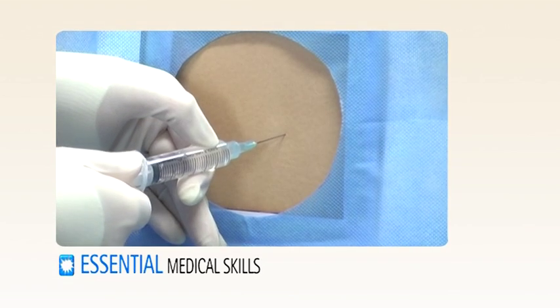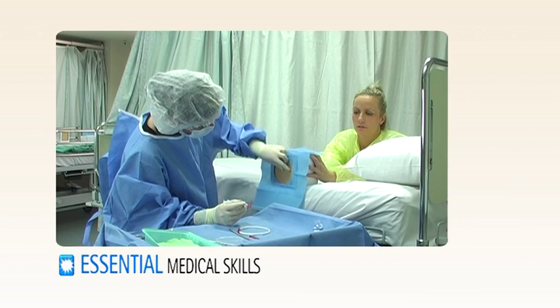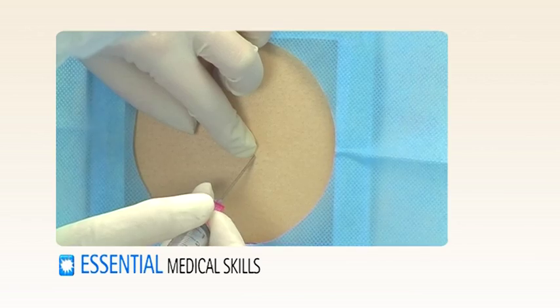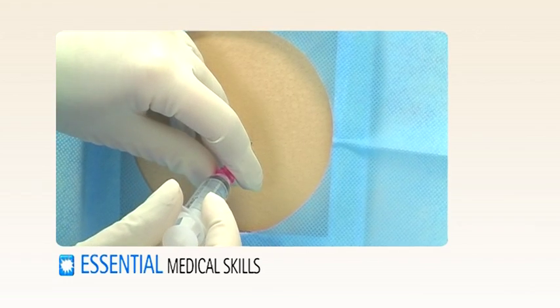Inject local anaesthetic into the intercostal space, identify the top of the rib, then insert the introducer needle connected to the syringe and pass this into the pleural space.